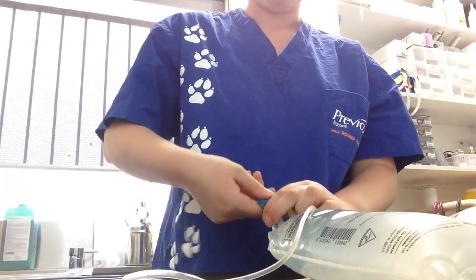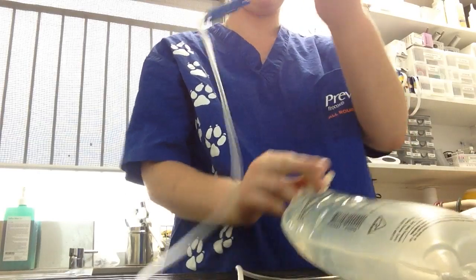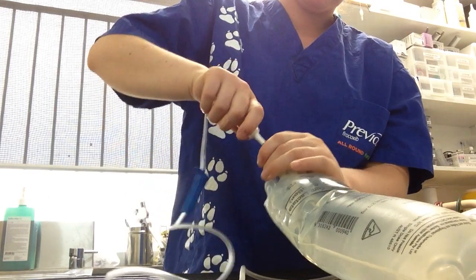I'm just going to show you setting up a fluids bag, for the hospitalisation of a cat who's been brought in for a stay today, and we'll be putting on fluids.